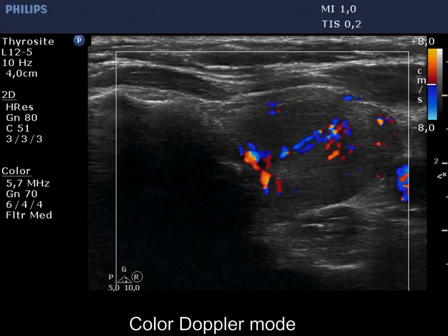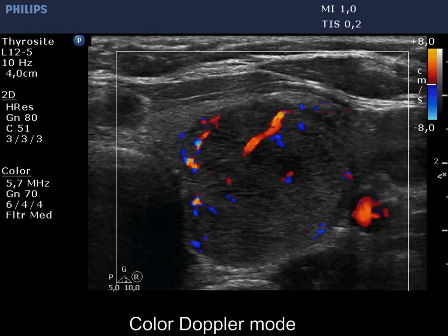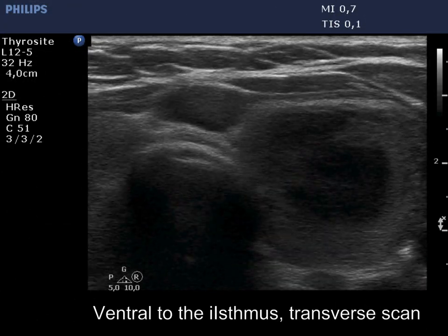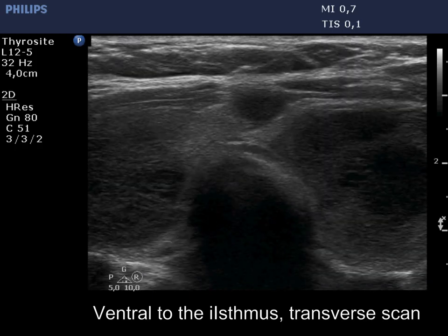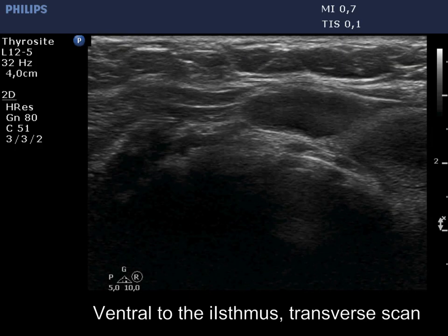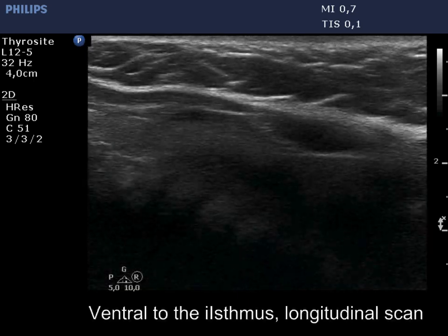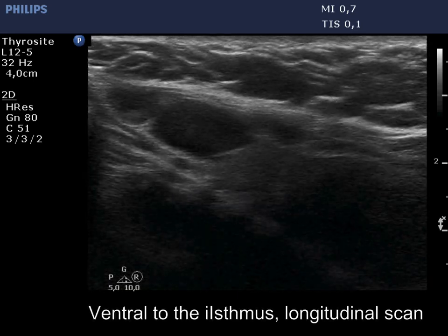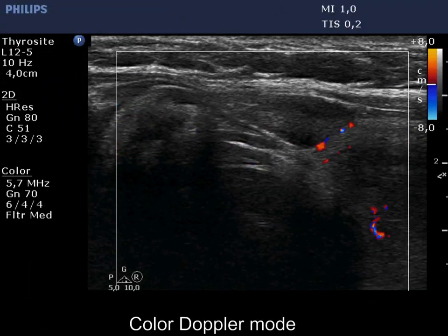The vascularity is increased in both larger lesions of the left lobe. There are two lymph nodes ventral to the isthmus, outside the thyroid. The nodes lack hilum and the larger has a heterogeneous pattern. The vascularity is not specific.